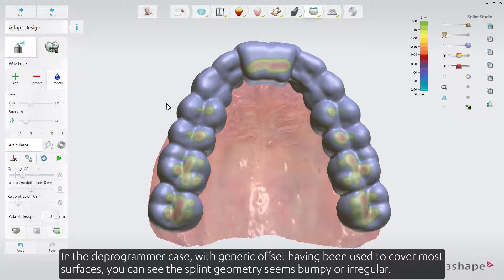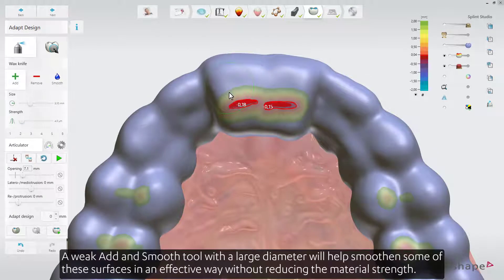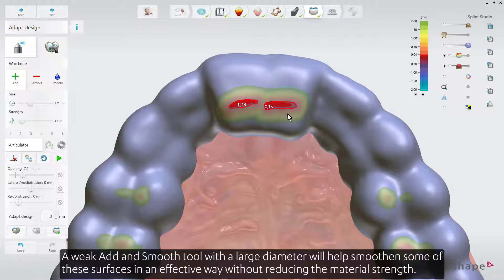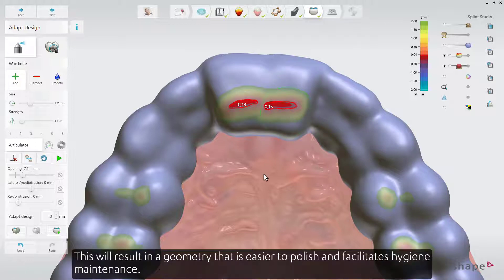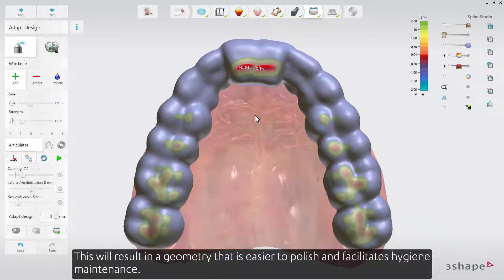In the Deprogrammer case, with generic offset having been used to cover most surfaces, the splint geometry may appear bumpy or irregular. A weak Add and Smooth tool with a large diameter will help smoothen these surfaces effectively without reducing material strength.